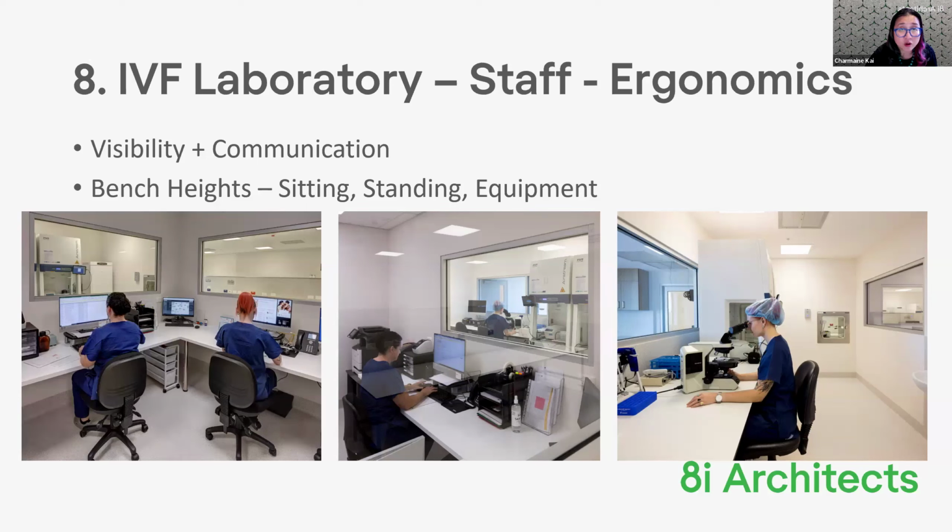So it really depends on whether the equipment is a tall piece of equipment or you're trying to fit equipment underneath a bench. That will vary. So you can have benches that might be 1.2 meters high because you need to fit an incubator underneath the bench, or you might have a bench that is 650 millimeters in height because you've got an incubator above a bench and you want to be able to access it. So it'll just depend.